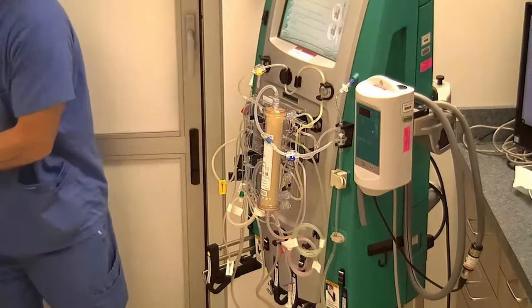What you're going to do is hang it on your priming hook. Take your spike and just slightly spike your priming solution. You don't have to clamp any of your lines. As nurses, we are more familiar with clamping our lines before we spike an IV. But if you do this properly, these clamps up here are locked or closed off, so there's no vacuum to suck your fluid out. So you don't need to clamp any of these lines.